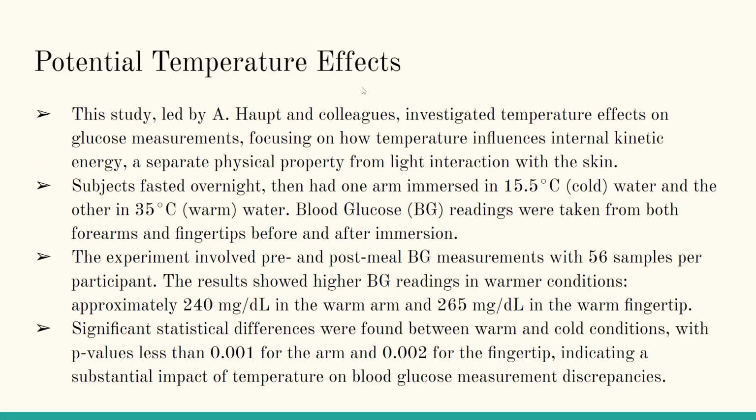And then the temperature effects, we're trying to see, like regular glucometers, those that prick the finger, if temperature affects them. And in fact, studies have found that there's a statistically significant difference between warm and cold conditions, and that is caused by lower blood flow when your limbs get colder, basically.